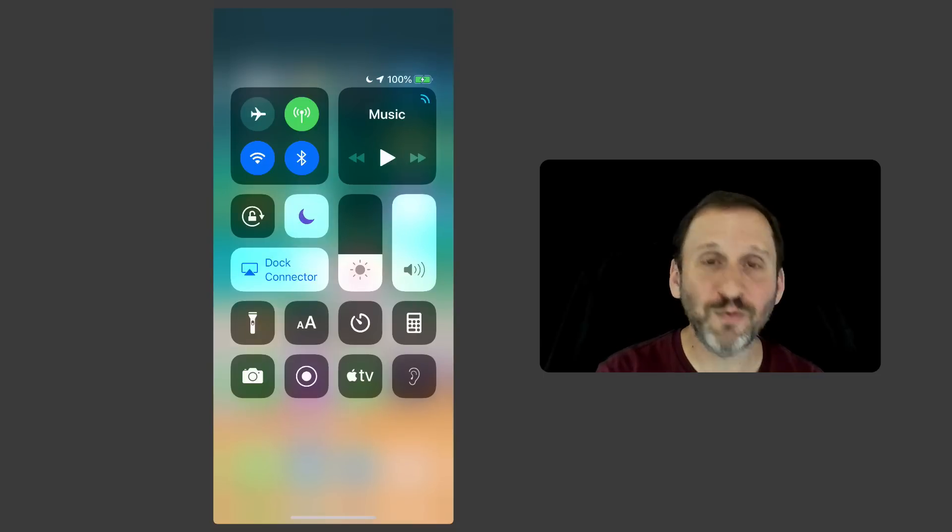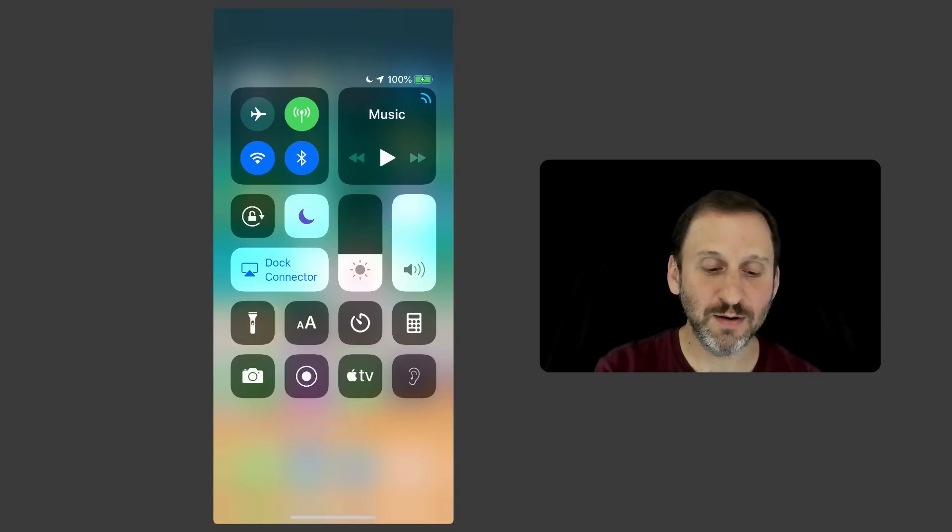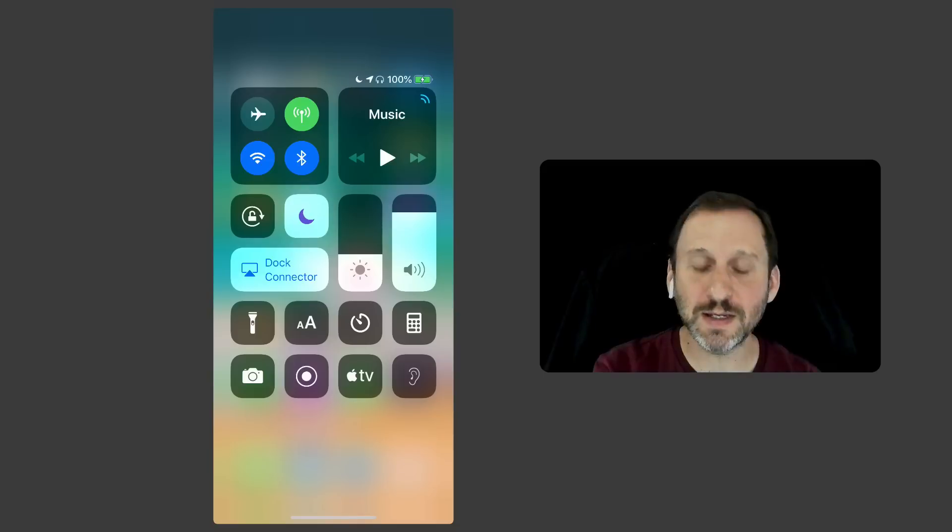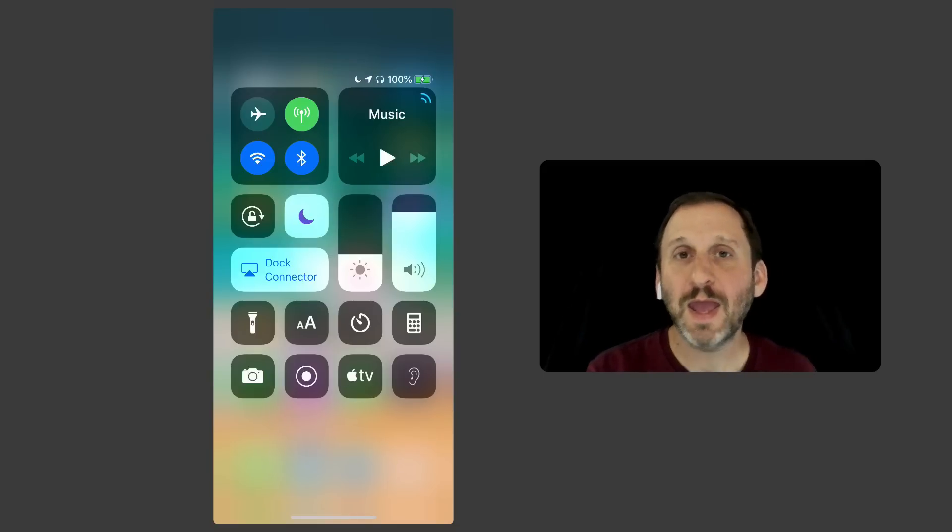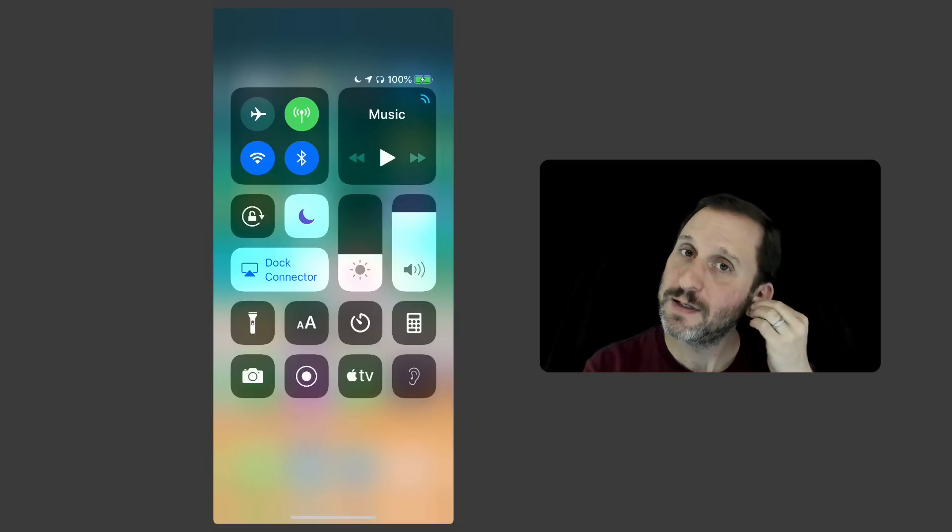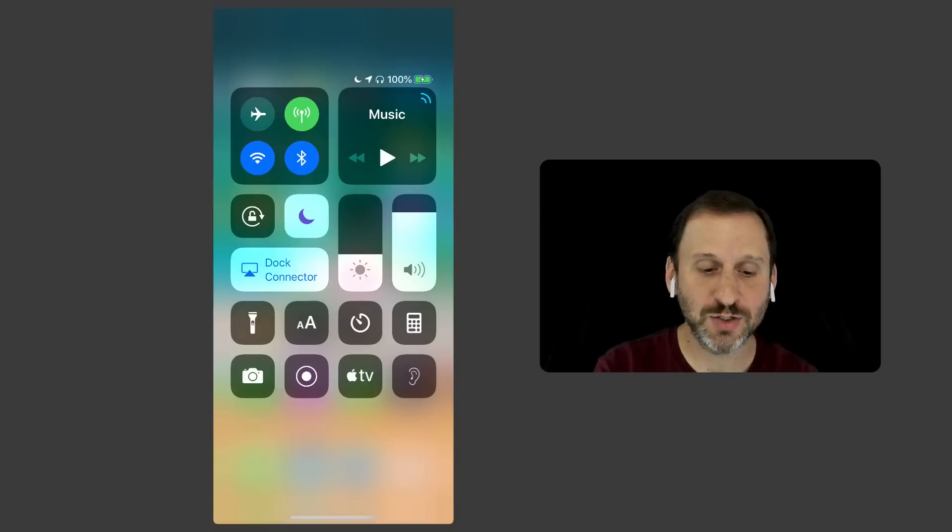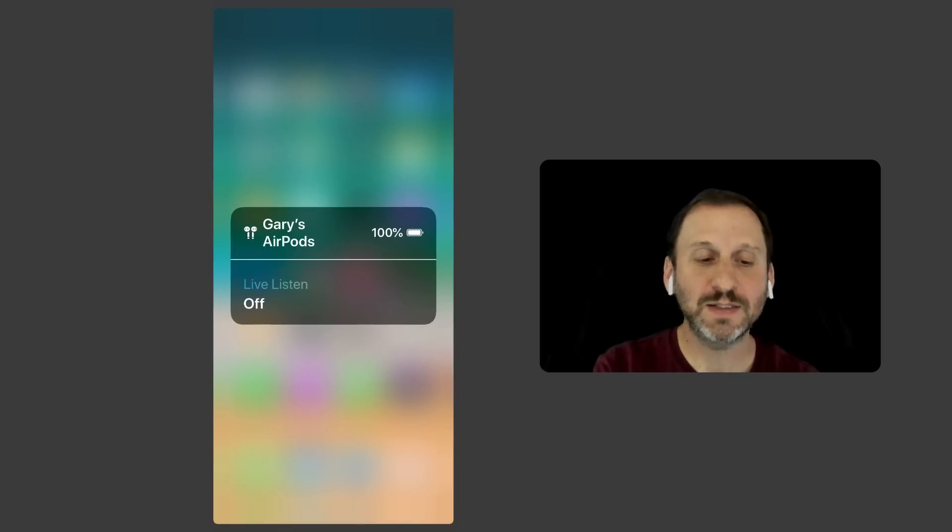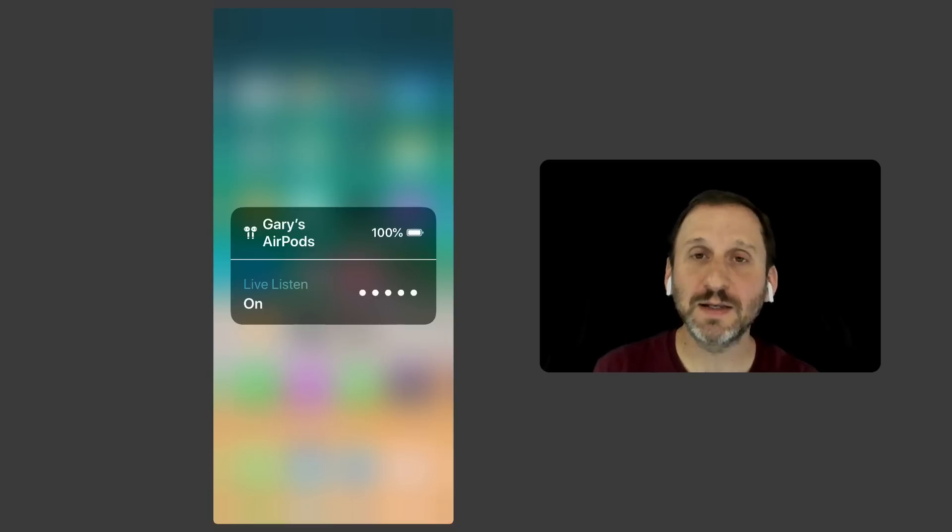Before I do that I'm going to put in my AirPods. So I put these in and now I can go ahead and turn this on. You can see here it shows Live Listen and it says Off, so I tap it again and now it's on.